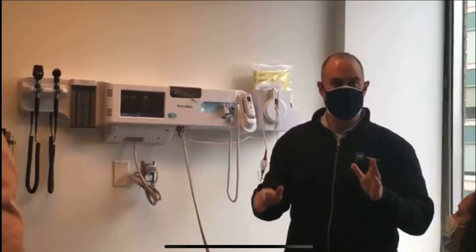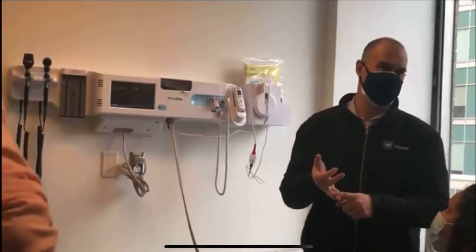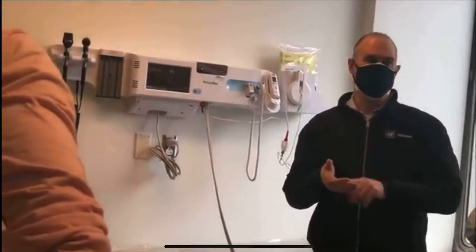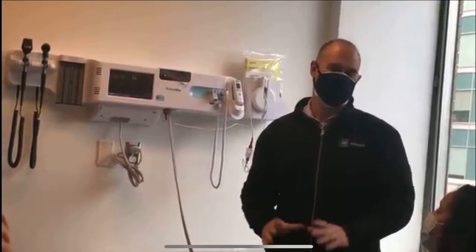That whole process will take about four and a half minutes, instead of the 20 seconds of doing a STAT one. You have 30 seconds to start, 20 seconds for a blood pressure, a minute, another 20 seconds, a minute, another 20 seconds — so roughly four minutes. Not going to have time for that?